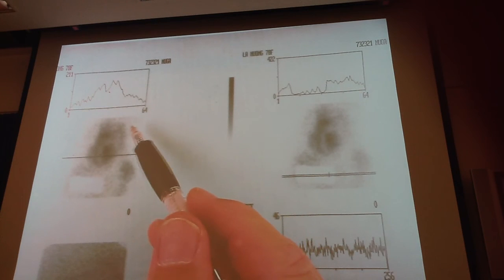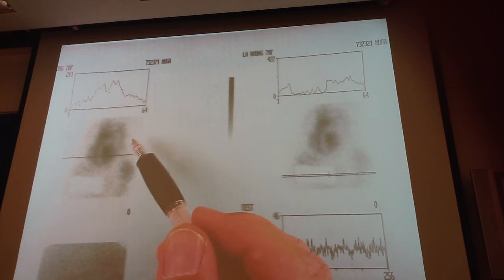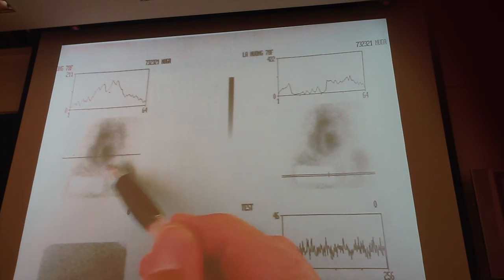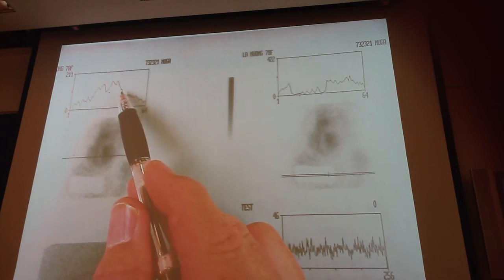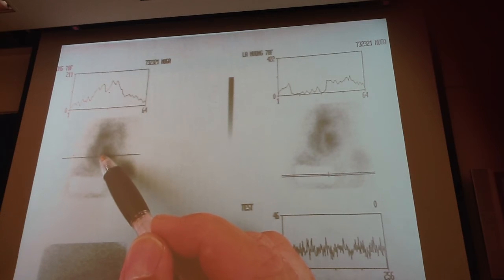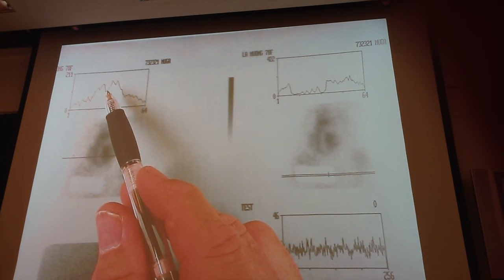When we were doing this, we basically just labeled the red blood cells. The computer would do what they call an ejection fraction. You draw a region of interest around the left ventricle. The computer would then identify these drop-offs. We would calculate the slope of this here, and the computer would assign a region of interest based on what they call the second derivation of the slope.